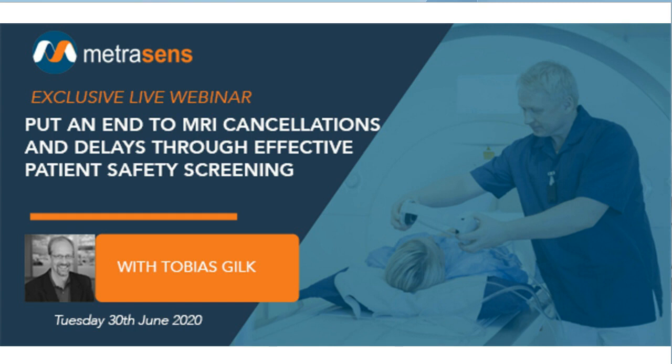Thank you. Next one. Will a ferromagnetic detection system at a doorway find hairpins and implants like you describe? It's important to draw a distinction between ferromagnetic detection for projectile safety versus ferromagnetic detection for small object or implant screening. The papers that have been published to date that identify the effectiveness of implant device screening with ferromagnetic detectors all use the screening system, which happens earlier in the process than the magnet room entry.